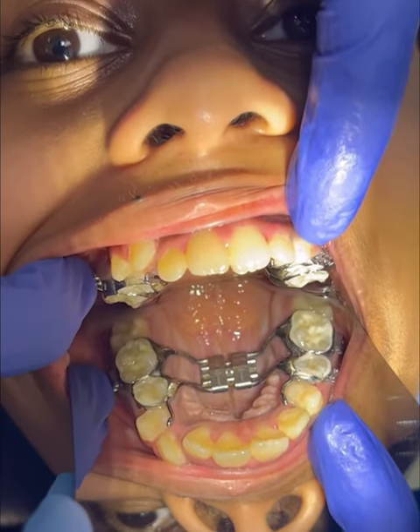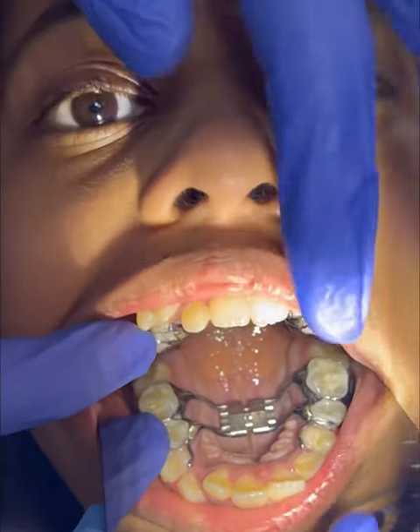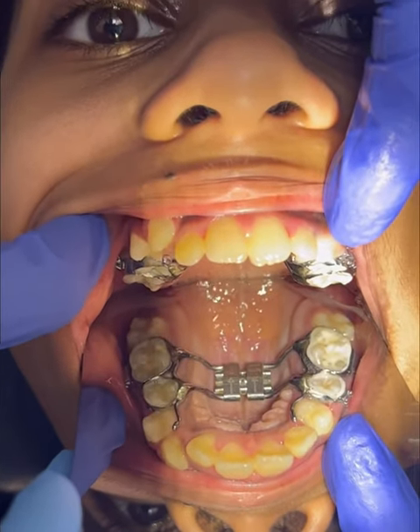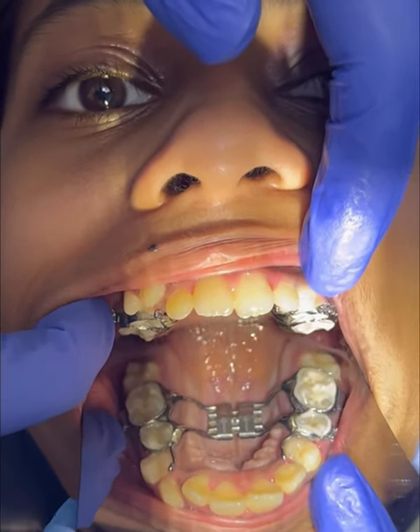We have two kinds of expansion: slow palatal expansion and Rapid Maxillary Expansion. This expansion — Rapid Maxillary Expansion — is used to carry out bone expansion in a growing patient. The advantage is to expand the upper arch so that we can align the teeth very well without extracting the premolars.